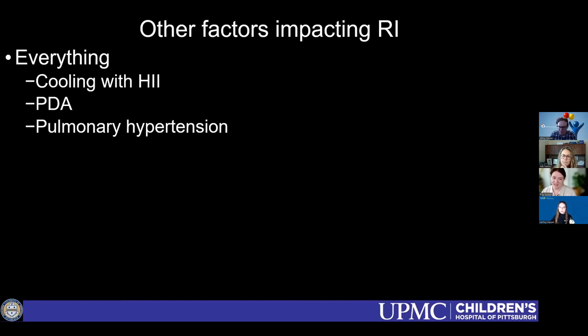Okay, so you would have to create like a brain ultrasound with Doppler then. Correct. Like for pelvis, we have pelvis with Doppler and pelvis without Doppler. So if we do spectral waveforms, we have to use that with Doppler.